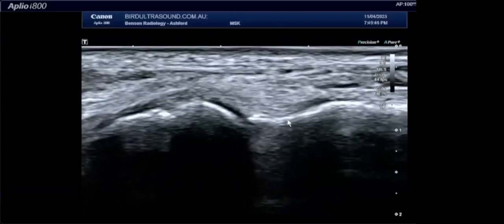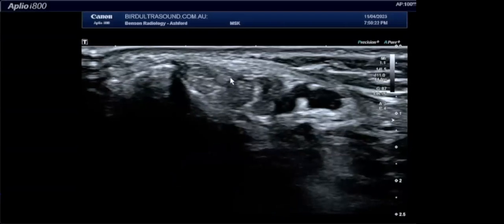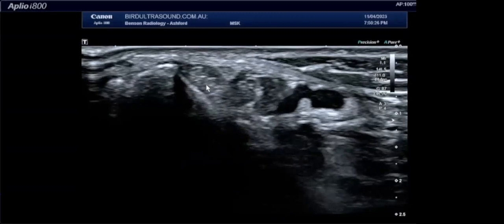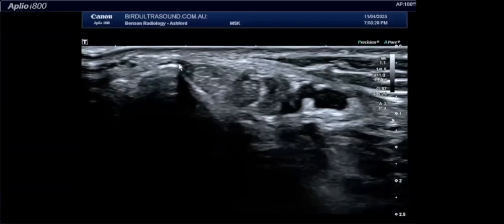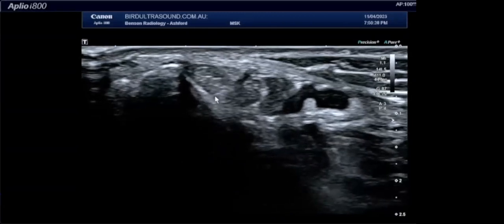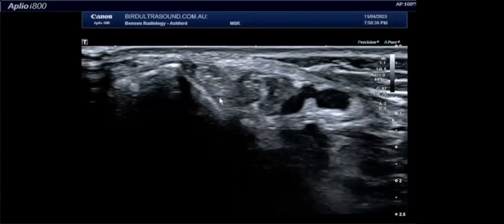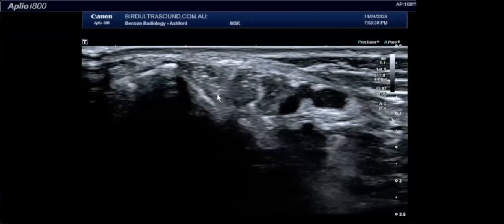On the medial side of the ankle, I'd like to have a look at the medial joint capsule, which we otherwise know as the deltoid ligament structure. People get very confused about the deltoid ligament and really make it overcomplicated, I feel. If you've had someone that's had an ankle injury, I think you can divide it into two simple parts where the majority of injuries occur.